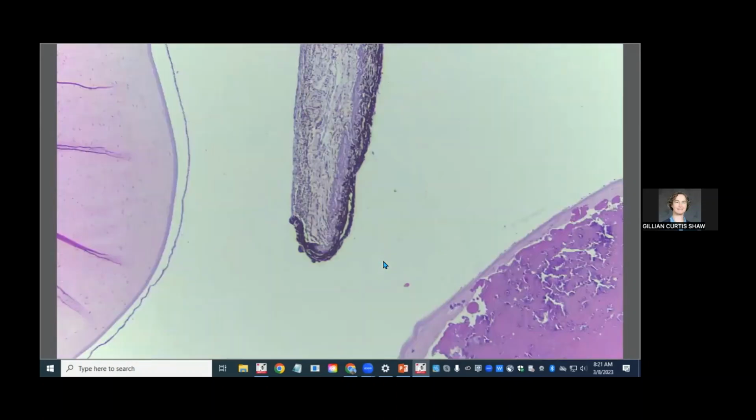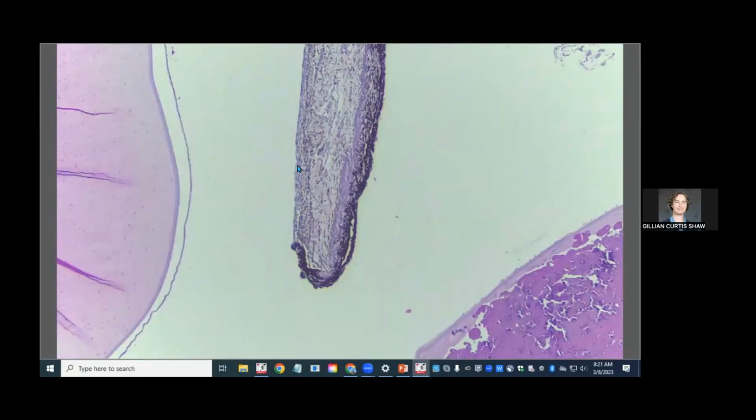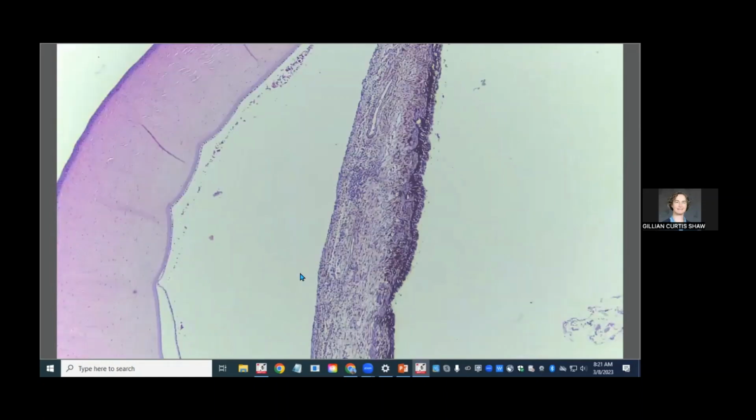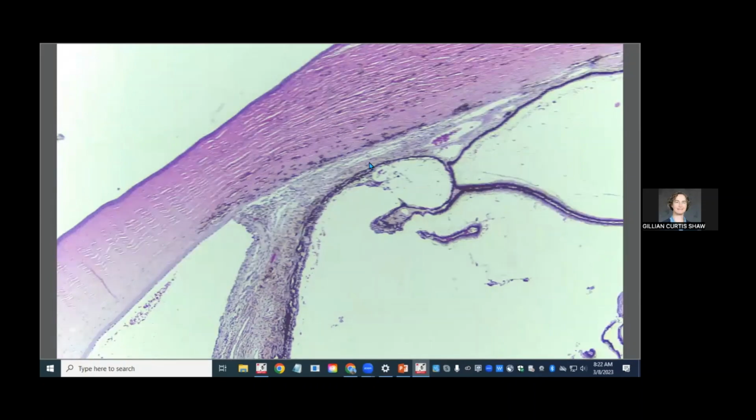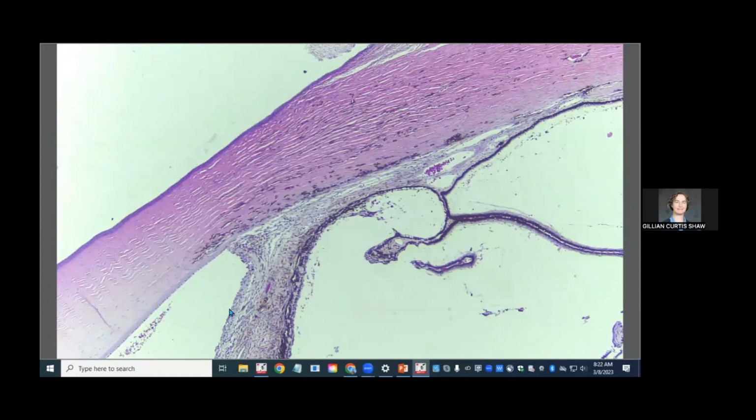We can zip over here. Here the membrane is causing ectropion uveae, so you can see that iris pigmented epithelium being pulled around. That's a good indication that there is a membrane of some sort on the front of the iris. And once again, on this side, the ciliary cleft is not open. You can make out some of the trabecular meshwork. It's not completely collapsed. And then the limbus is a little bit indistinct here. Normally the peripheral cornea meets the scleral collagen in a fairly straight line.